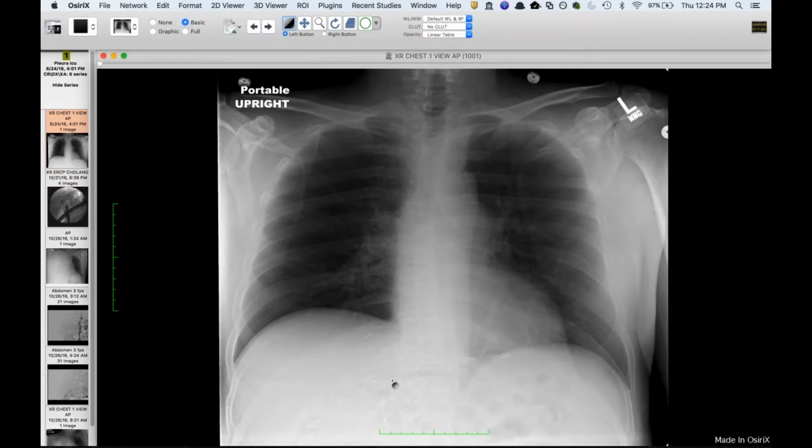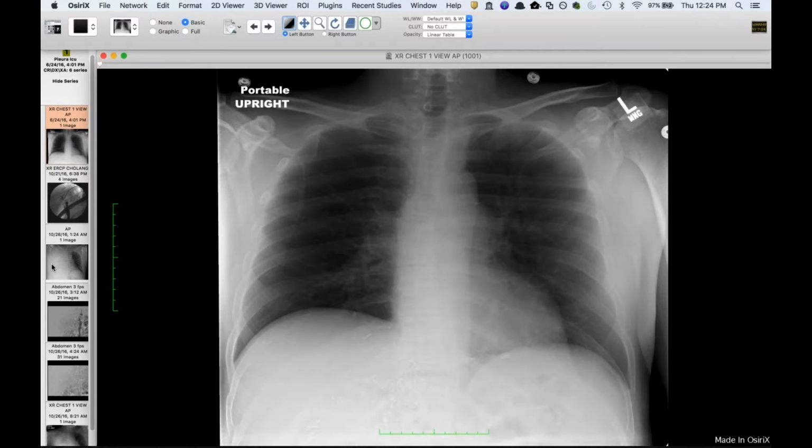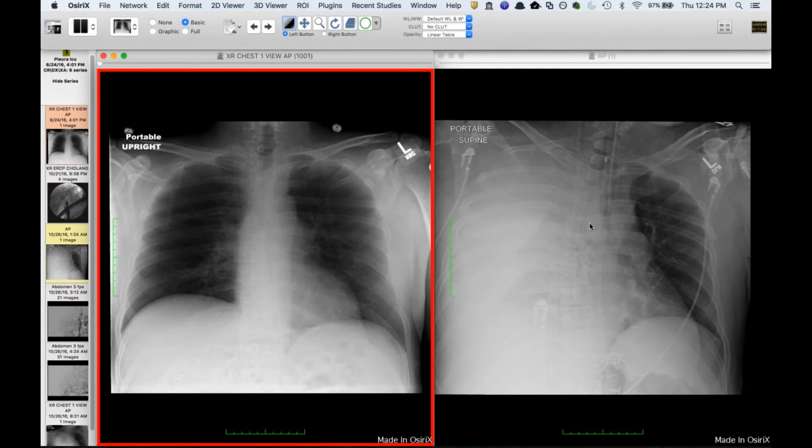So this is a patient who you can see has had quite a bit of liver surgery. He has liver disease, which comes into play here, but here he is on the 24th. This was a few months ago, but he would look the same on October 24th too, because on October 26th, you can see he's now intubated in respiratory distress and has this new essential whiteout of the right. You can see a little bit of aerated lung, but there's significant shift of the mediastinum away. He has this new line, and we've all seen cases of hemothorax from line placement, but certainly you're worried about a hemothorax or rapid accumulation of some fluid.